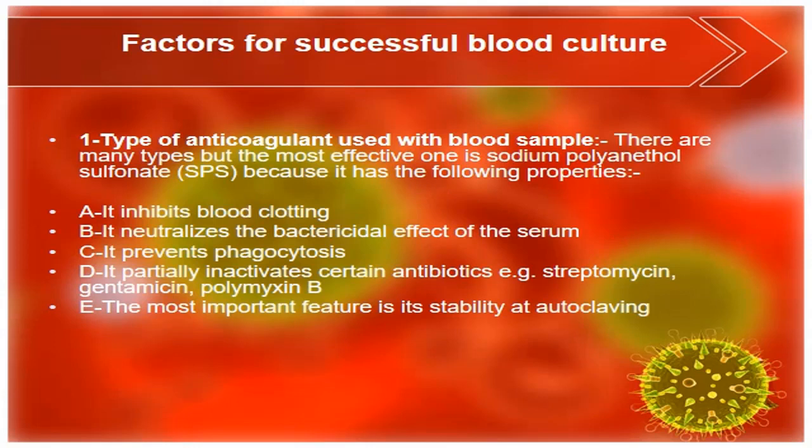Now, there are several factors for successful blood culture. What are these factors? First, the type of anticoagulant used. As you know, for each blood culture experiment, the anticoagulant used must be selected precisely.